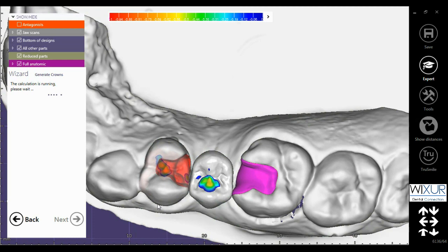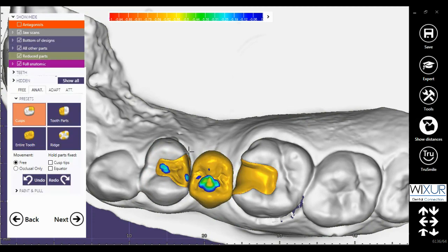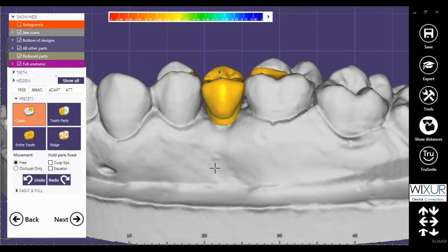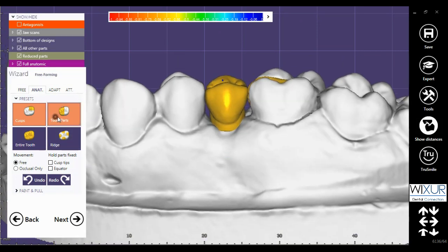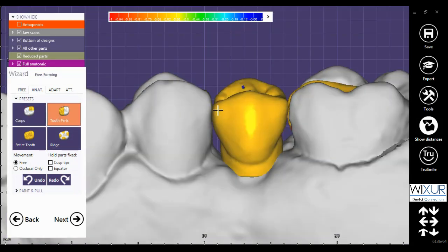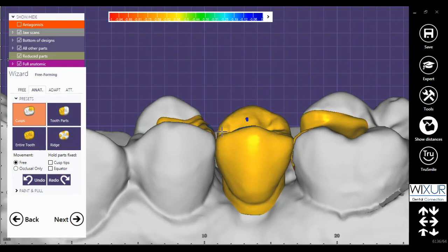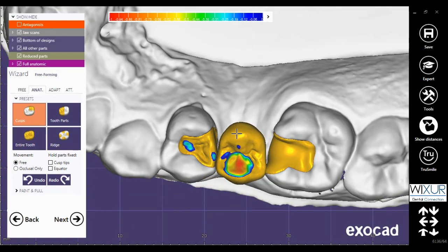Next. Now the calculation is running. As you can see, the mesial side of the crown — the pontic — is anatomic, and the distal side is an offset. Now we complete the design. If you need more information about designing, please check other videos from Vixer.